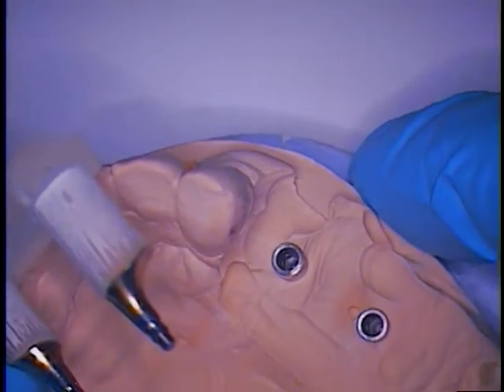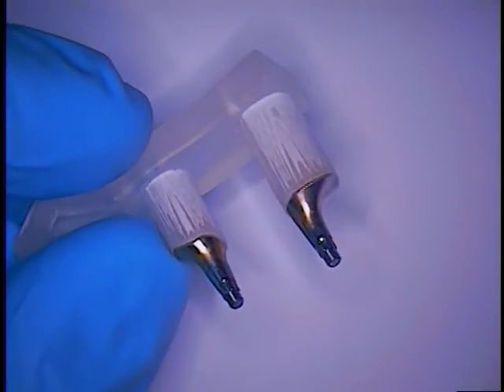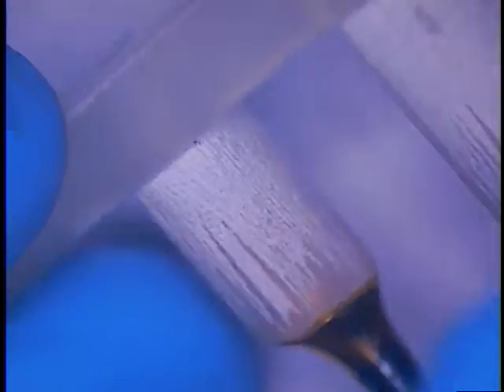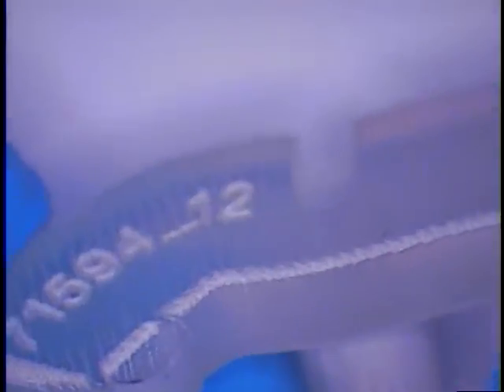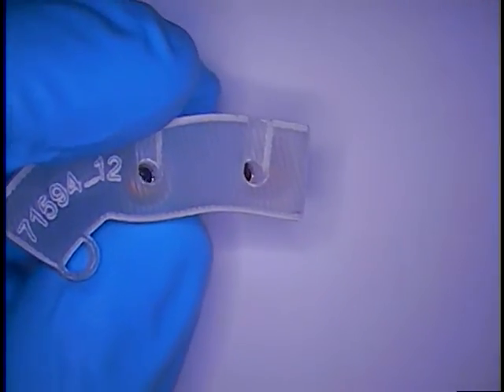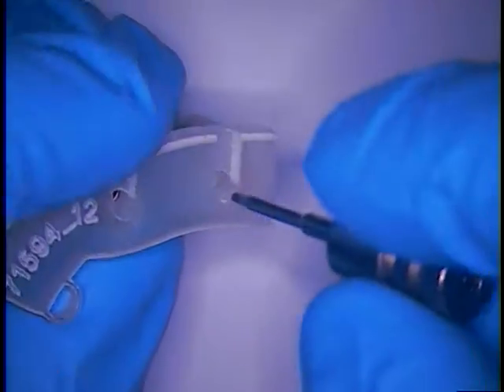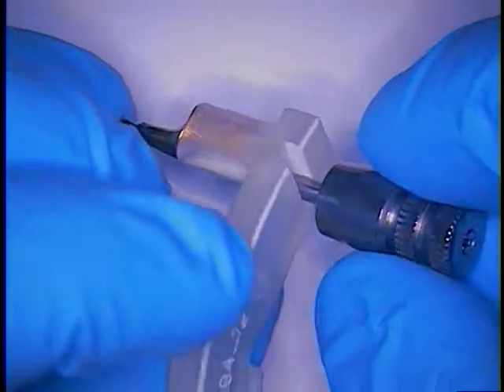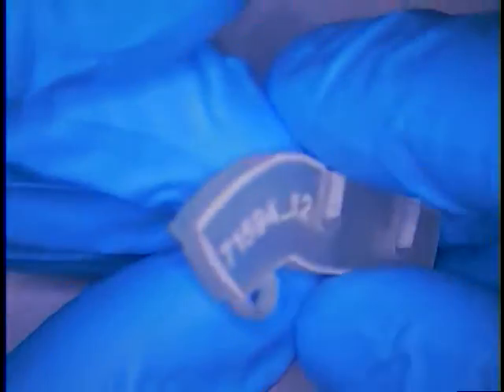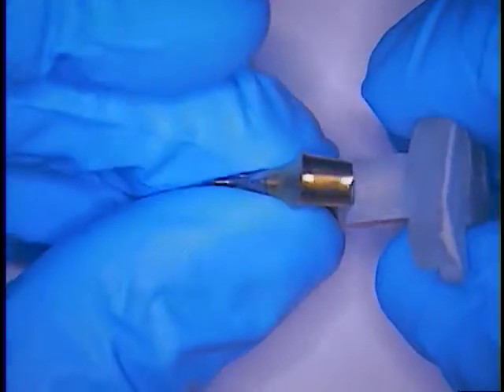So that's what we're going to be doing today — just to show you the model work here without the tissue in place. These are the size of the analogs. This device, also from the same company, is printed. It's called a try-in jig, and you can also use your drivers to come through the top of this in the mouth, just lightly hand tightening in the mouth first for all the try-ins. Then this pops off and your bridge is tried in.